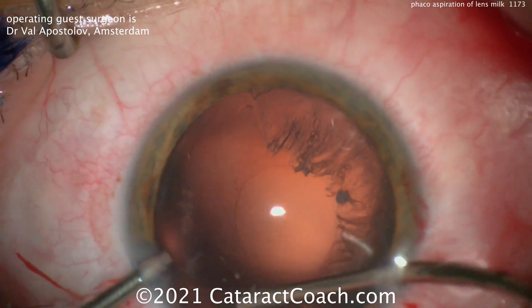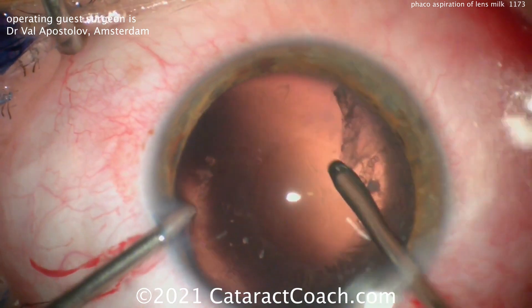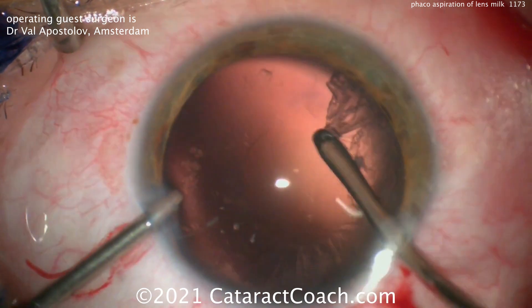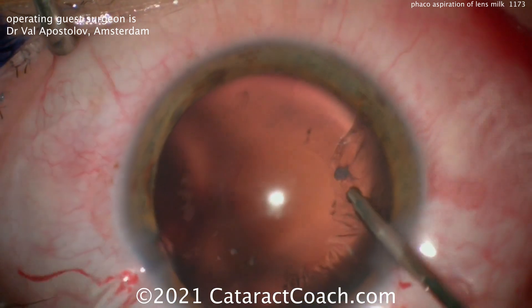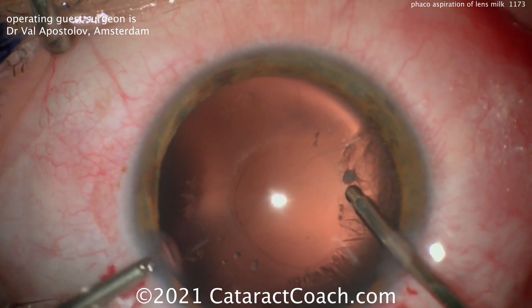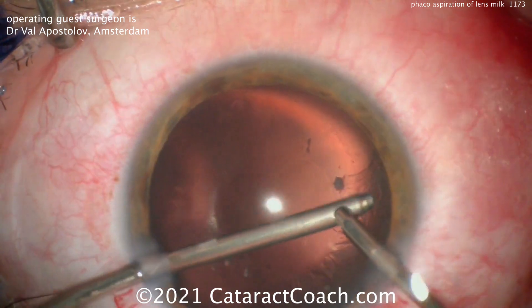Much better access than trying to do the coaxial method. In some parts of the world the coaxial irrigation-aspiration is the more common method — that's here in the US. In other places like Europe or Asia, you may find that the bimanual approach is a lot more common, but certainly either is fine.